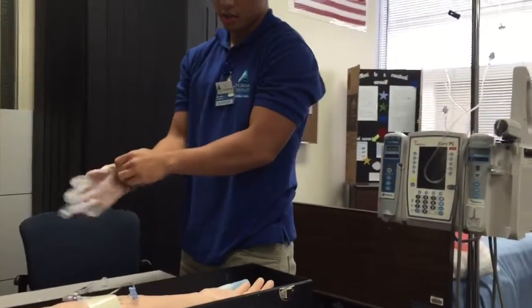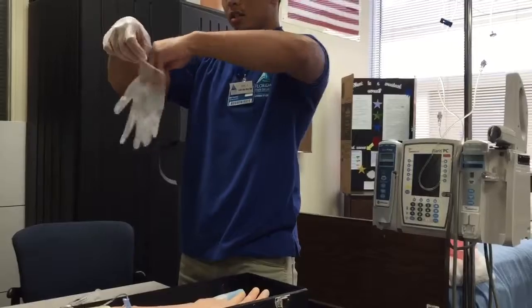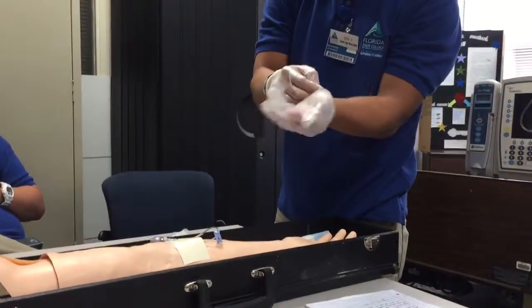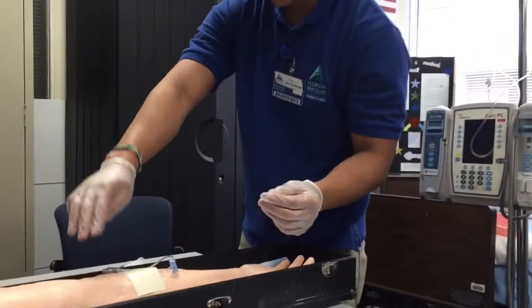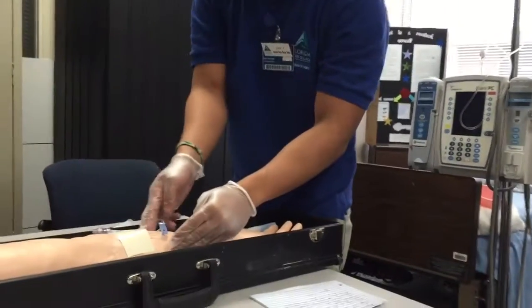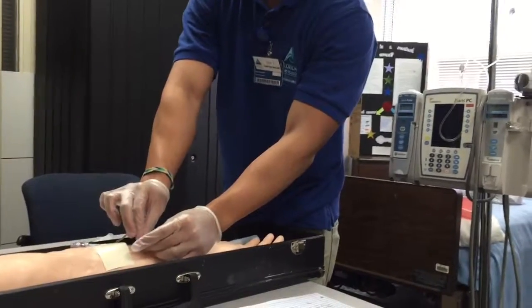Put that on. I'm going to inspect the IV site for any redness, any tenderness, any phlebitis, edema, or anything of that sort, just to make sure that the vein is still good and still patent. I'm going to go ahead and give you a little feel right there. No pain or tenderness right there. It's not warm to the touch. There's nothing visible that looks wrong with it. Make sure it's just clamped already.